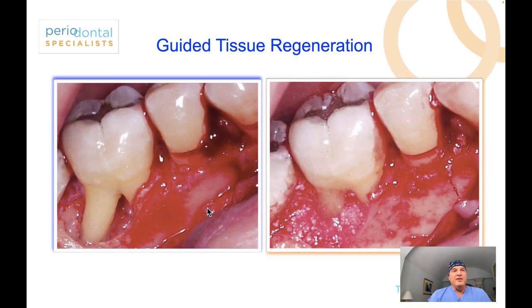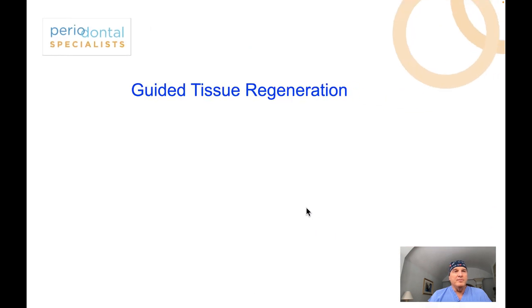Another example is this case demonstrates furcation being filled using the bone graft technique, where there is good place to pack. We have 3 walls to pack here in the furcation. This will hold the bone nicely, and good outcomes are predictable.